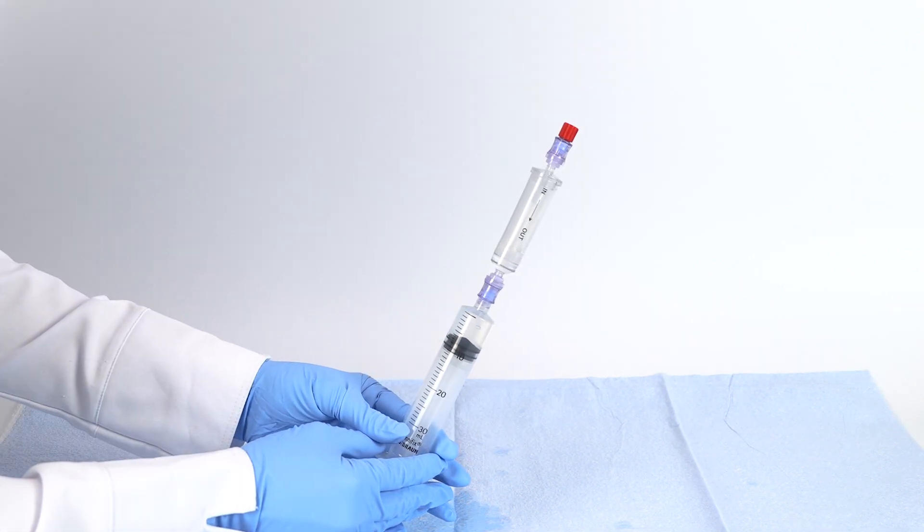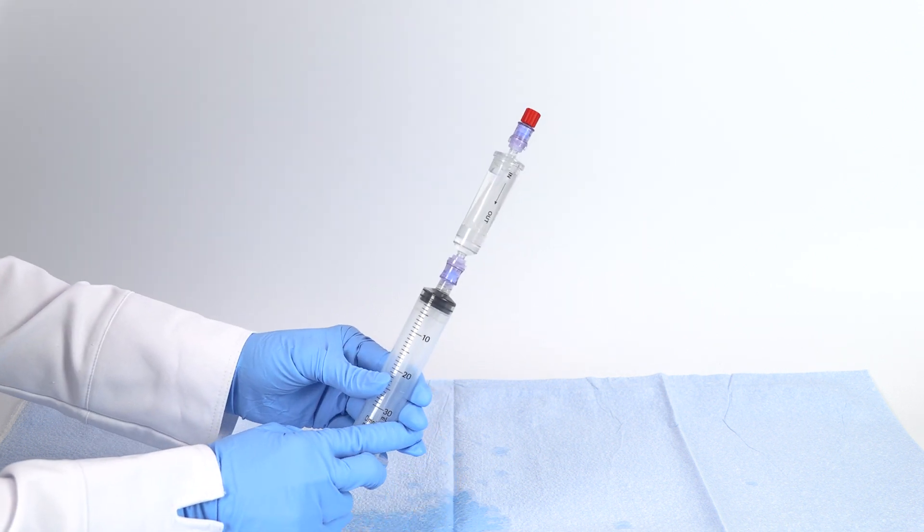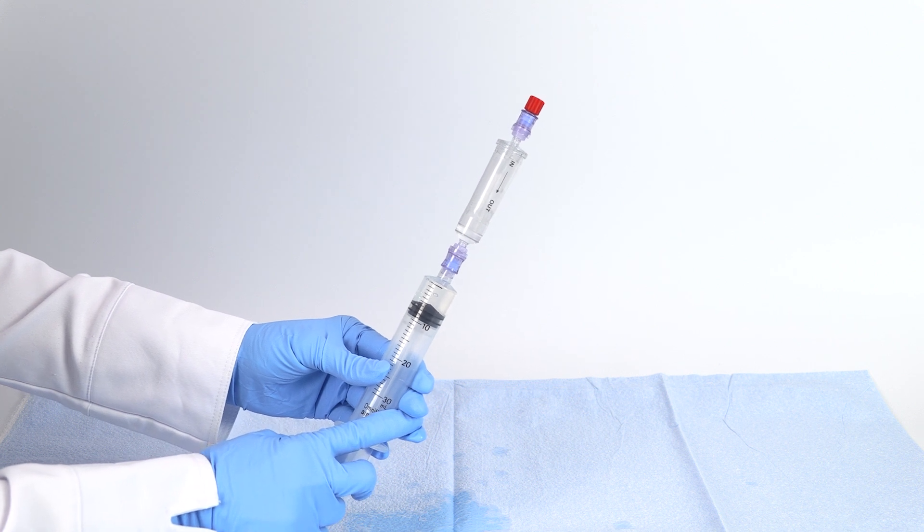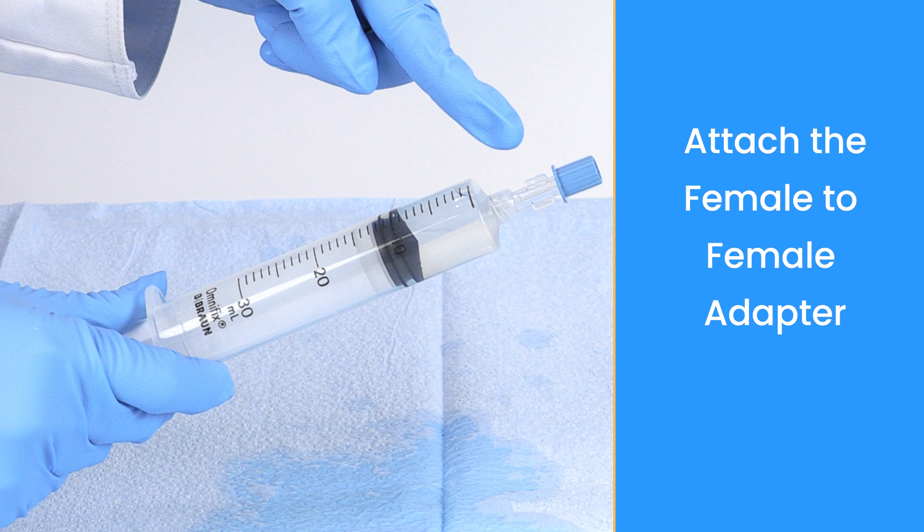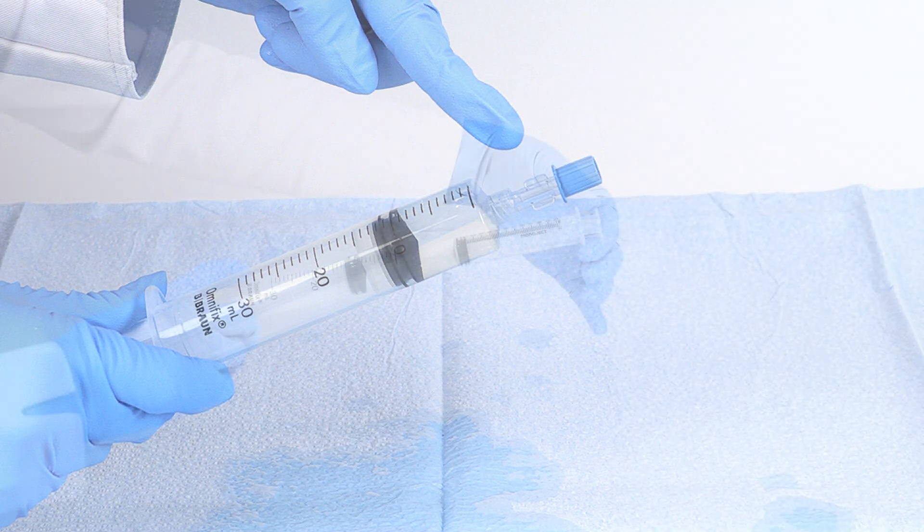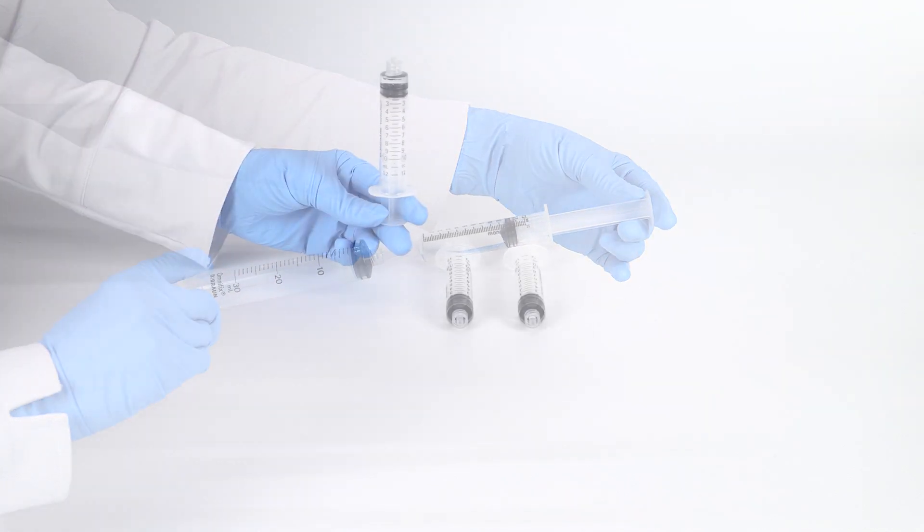Connect the heparin syringe to the outport of the BMA filter and prime the filter by injecting and removing the anticoagulant. Transfer the heparin to three 12-milliliter syringes. Put one milliliter of heparin in each syringe.